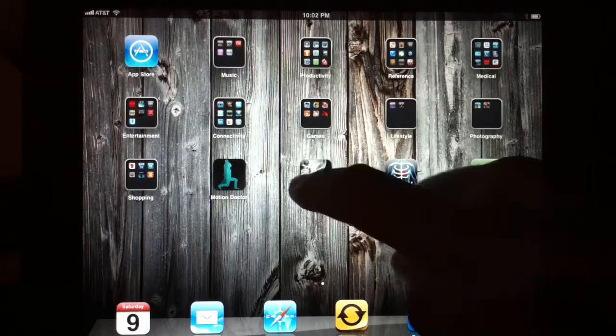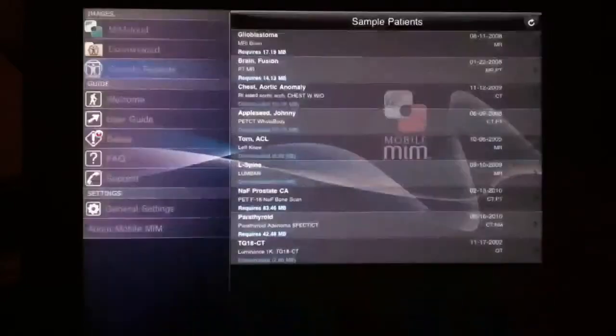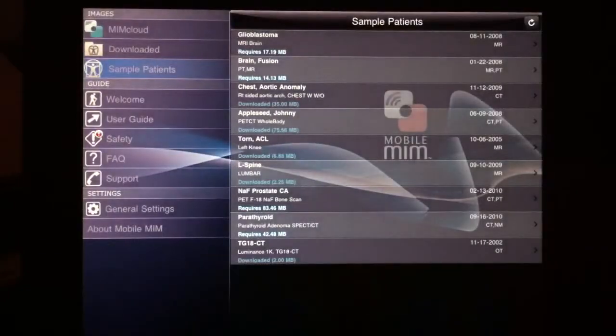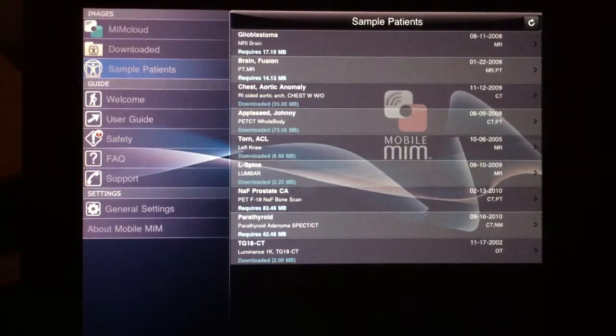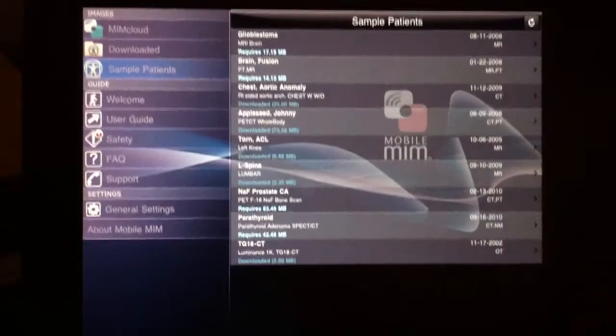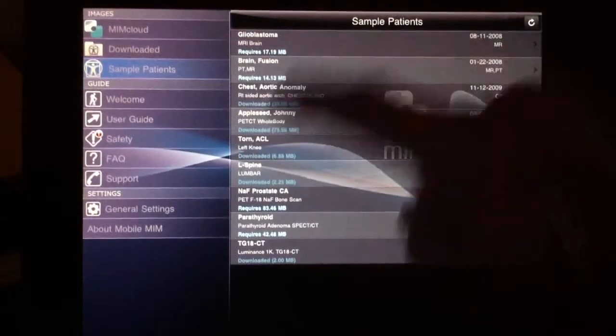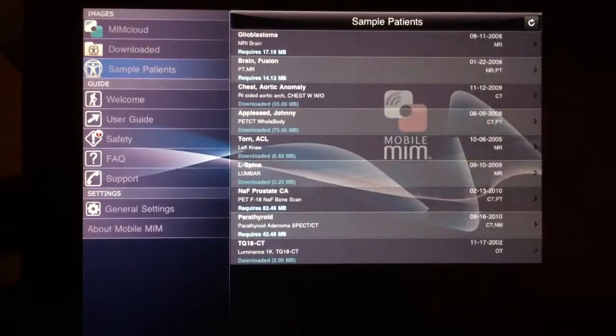This is a brief demonstration of the Mobile MIM iPad Radiology Viewer. When you first log in, the first thing you notice is that there is a list of options on the left, and on the right are the studies.